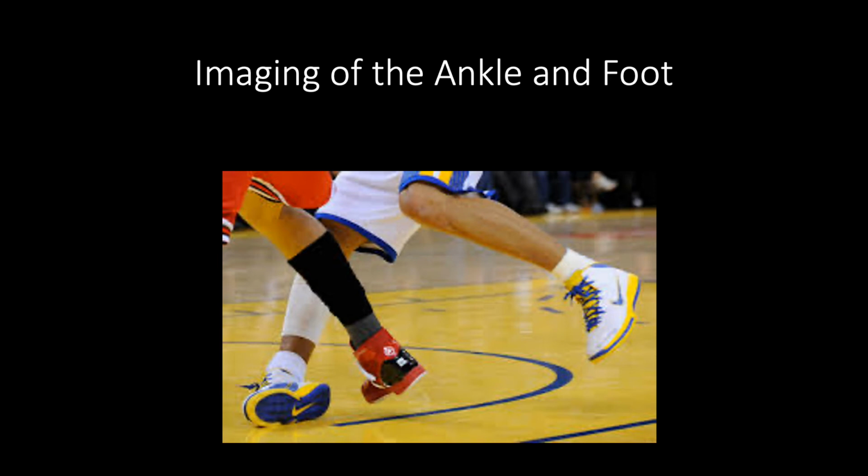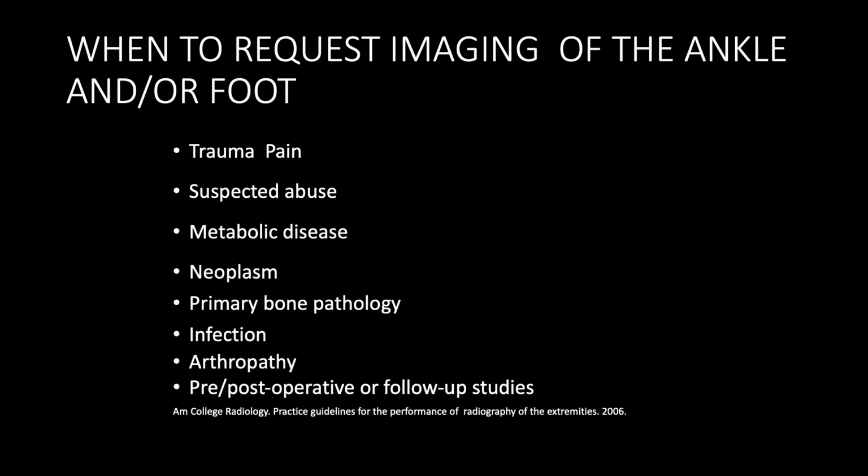Okay, in this lecture we'll be covering imaging of the ankle and foot. So when do we request imaging of the ankle or foot? Typically with trauma, in pain, occasionally with metabolic disease or neoplasms, but very seldom typically. We may look at it for pre and post-op studies as well.